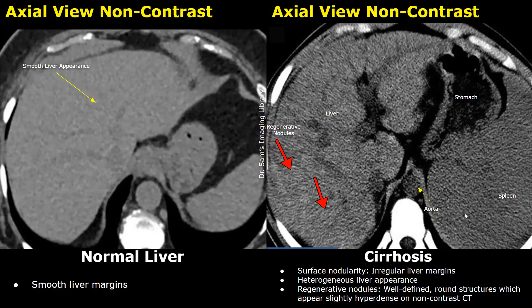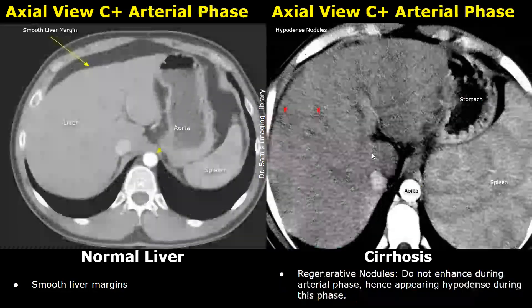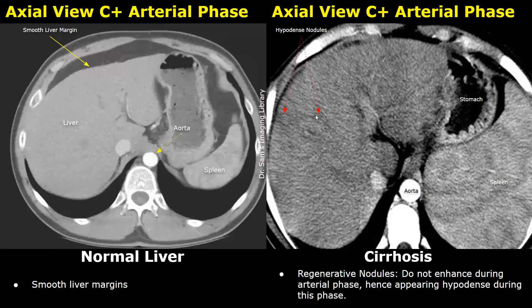This hypodense area is the portal vein. This part of the liver is the caudate lobe — in cirrhosis, the caudate lobe can increase in size. During the arterial phase, the regenerative nodules do not enhance; hence they appear darker or hypodense. You can see hypodense round nodules within the liver appearing darker than the surrounding liver tissue.